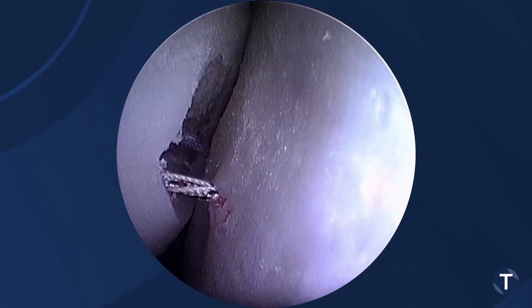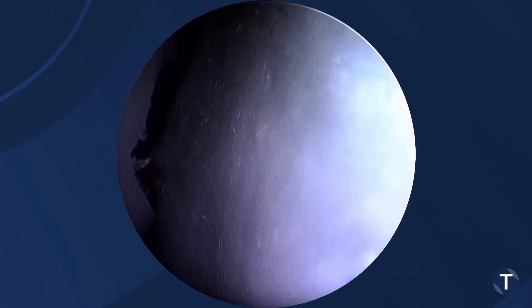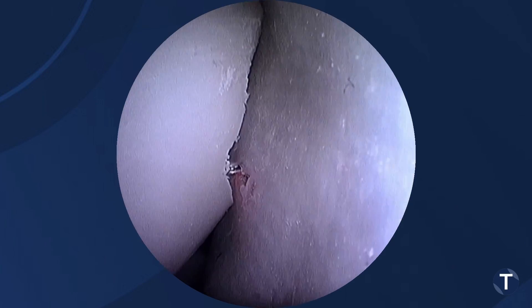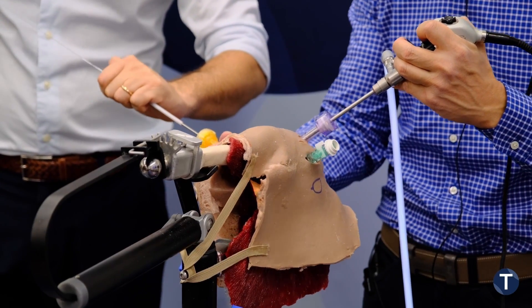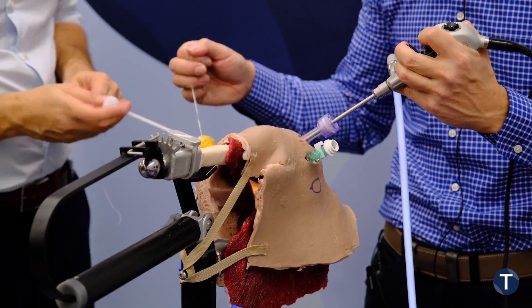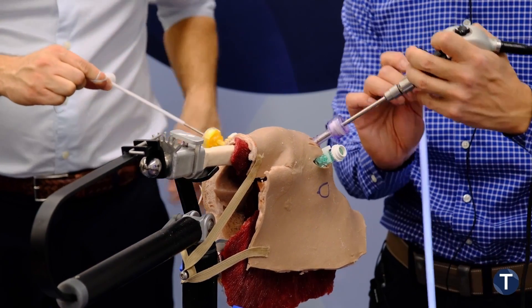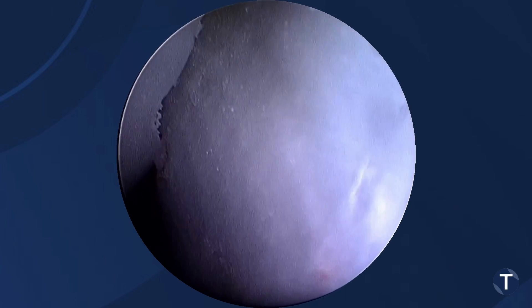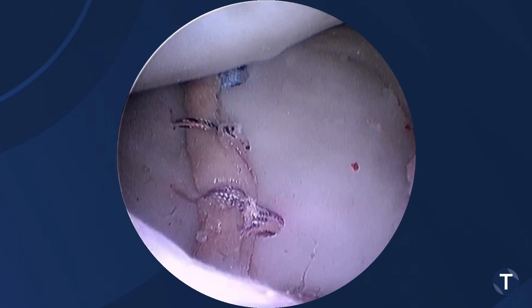Go ahead and pull those sutures. As he pulls them, the knot will go into the subluxed subacromial bursa and start pressing that against the Hill-Sax lesion. Of course, we have to finish off and tie the rest of the suture loop, so we're going to tie a static knot now. You can see how he's tying these knots — it finishes the suture loop and now opposes the tendon against the Hill-Sax lesion. You can see how it's all opposed. That's our remplissage. When we come back, we can see our Bankart repair — we'll see you there.